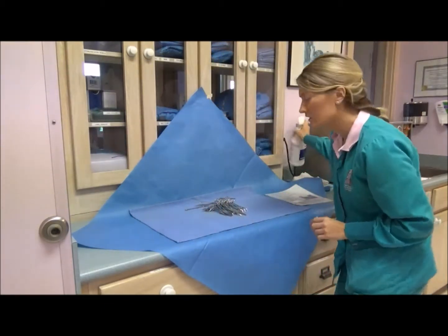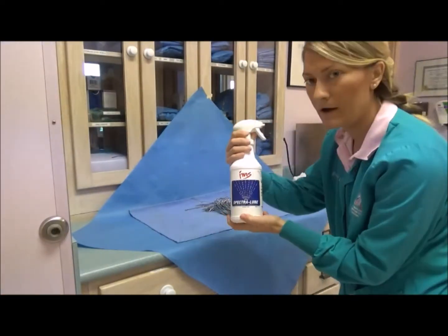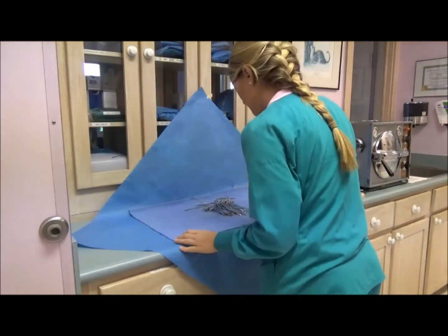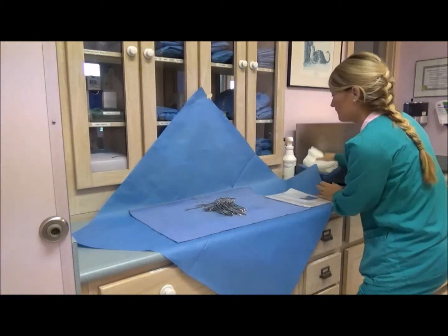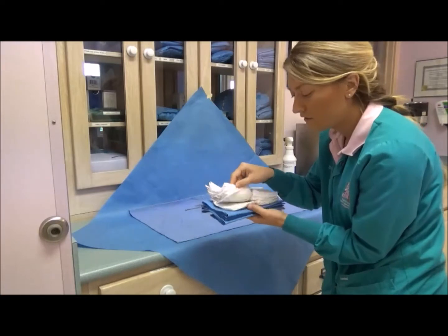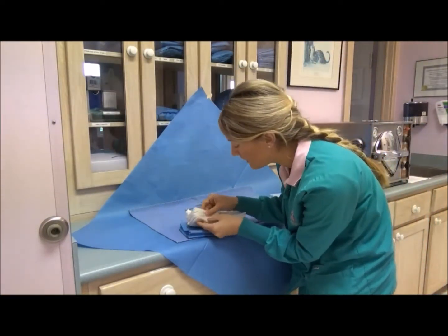And then the next thing I'll do, I'm going to spray all the box locks and joints with some instrument lubricant. Okay. And then next in our pack, we're going to put a surgical drape and sponges. I pre-counted out my sponges. I'll just double check them again. We'll always put 20 in our pack.